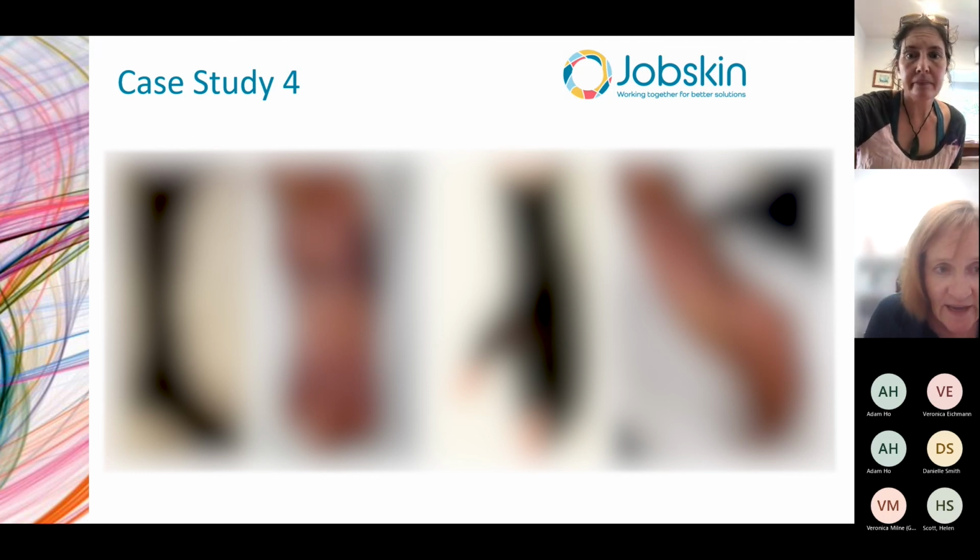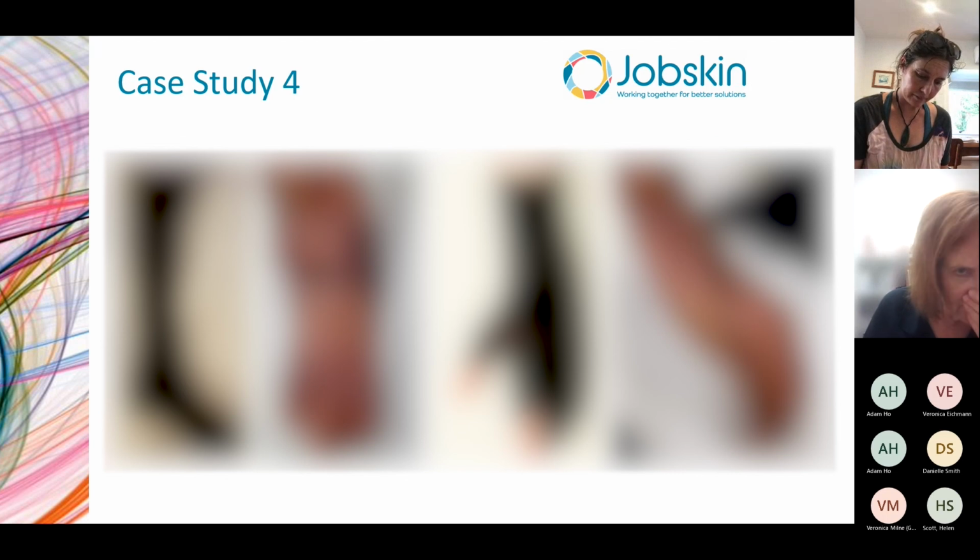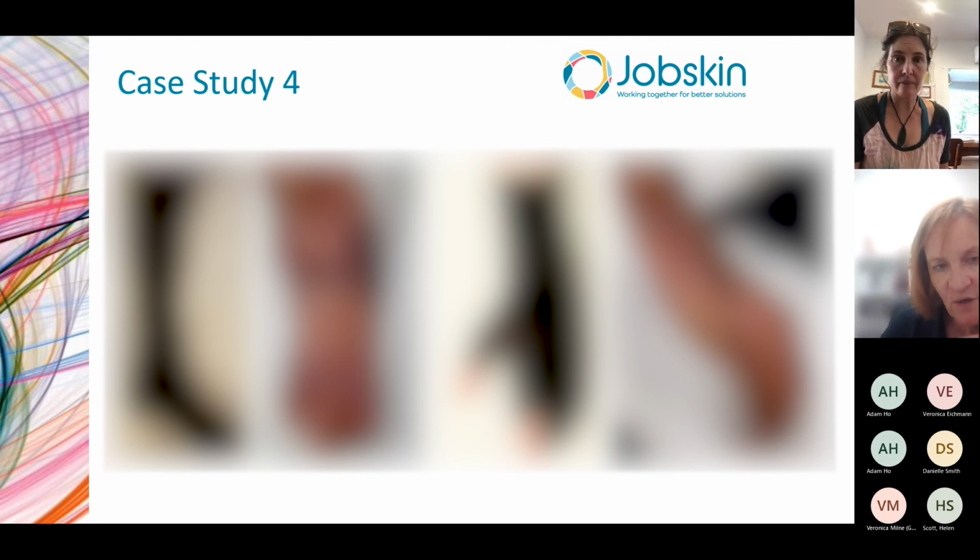And so he had a zip that went down just behind the, I think I said lateral before, that's the medial side where the flap was. I apologize. But he had a zip that went down the lateral side of the garment behind the malleolus and sort of just went into the beginning of the foot so that he could get that garment on safely and that there was no risk to the flap in the early period of time.